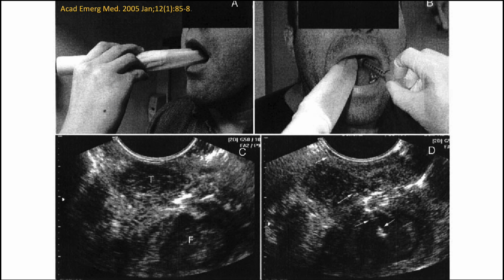Now, most of the time when I see these patients, depending on my work setting, I like to diagnose these using an intraoral ultrasound technique, using an endocavitary probe, and essentially placing it directly on the area of swelling and taking a look at it, and then often even draining these either dynamically or statically. But in some places that I work, I may not have ready or easy access to an intraoral probe, and so there are alternatives that we're going to talk about.